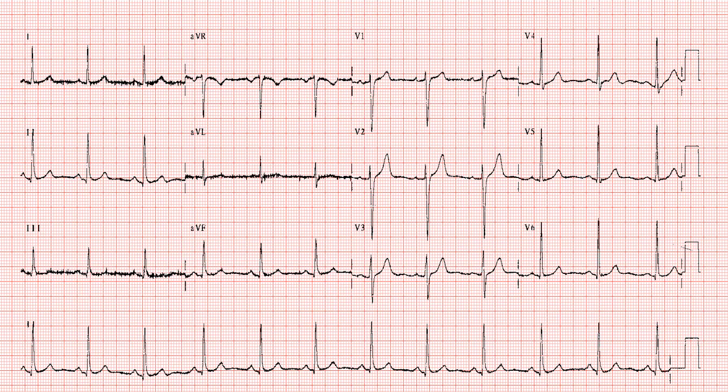So we have an ECG strip there. Now let's try to see if the rhythm is regular or irregular, and afterwards try to calculate the rate. So put your piece of paper, mark 3 QRS complexes, 1, 2, 3.